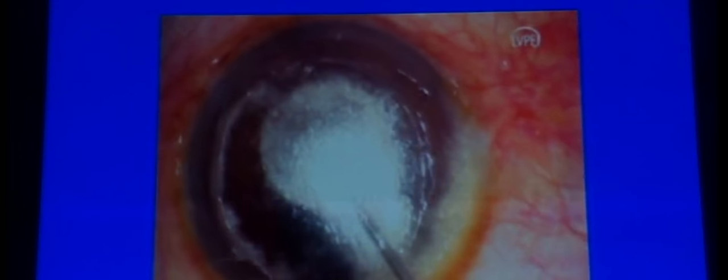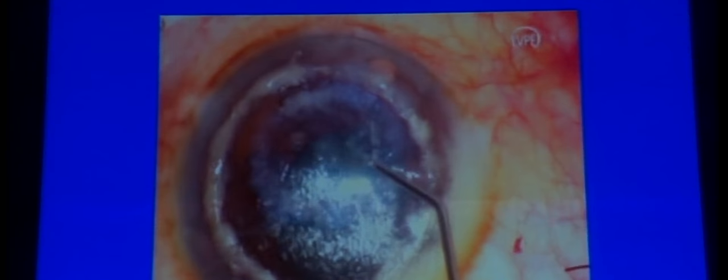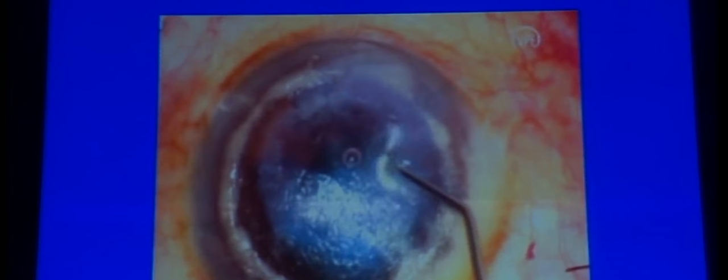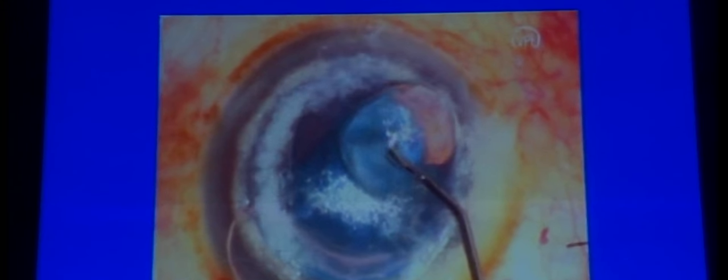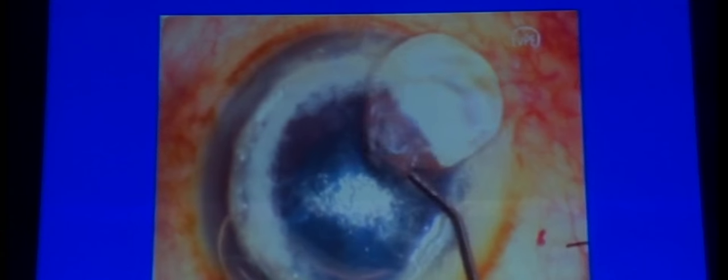In the surgical video for a corneal dermoid, a hydrodelamination technique was used. When a partial bubble is obtained, viscoelastic or fluid can be used to expand the bubble into a pre-Descemet plane for a successful DALK. Pre-Descemet DALK is preferred in the pediatric age group — it is easier, Descemet separation is more difficult to obtain in this age group, and there is a lesser risk of perforation.